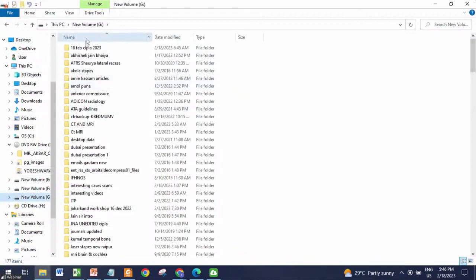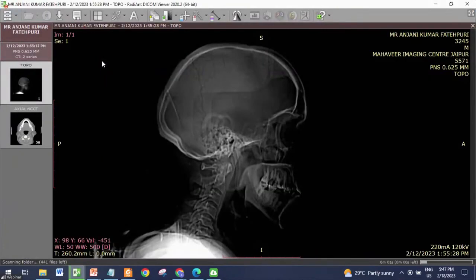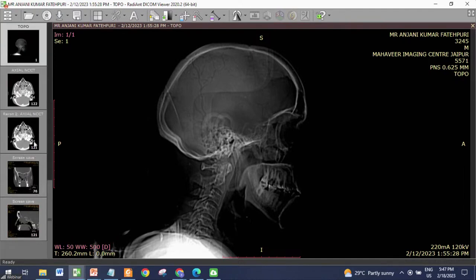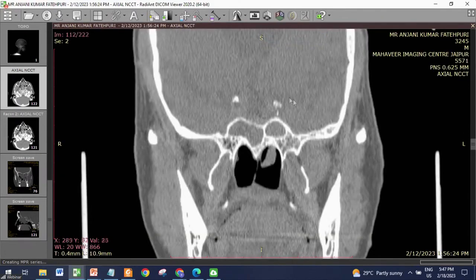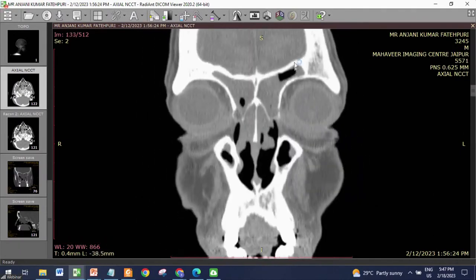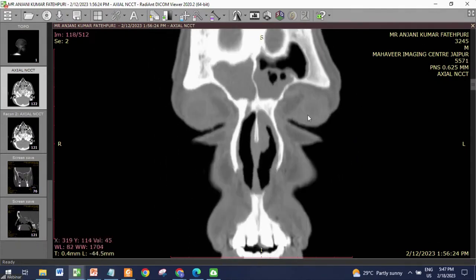Sir, one more question. In the second case, whenever you are packing the nose, do you give a pack in the middle meatus, sir? Yes, on both sides, for two days. And along the inferior turbinate, the other one, two packs on each side, two long packs on each side, and the rest small in the cavity. And all the packs are removed after two days, I mean 48 hours, right, sir? Roughly. Which pack do you prefer, sir, to avoid adhesions? Using simply Merocel, nothing else.